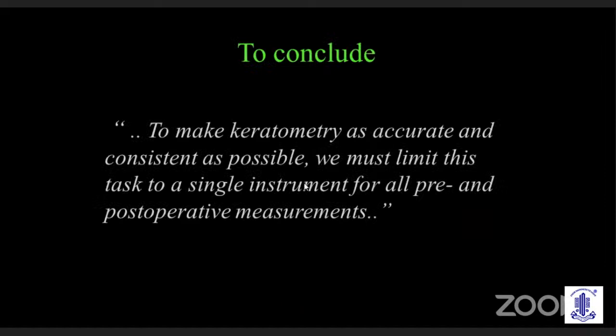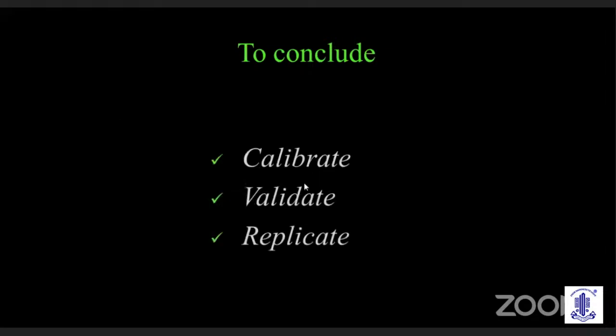So to conclude, to make keratometry as accurate and as consistent as possible, we must limit this task to a single instrument for all your preoperative and postoperative measurements. Kindly understand all the workings of an instrument and then go ahead. Make sure you calibrate the instrument periodically. Validate all your measurements before you finally reach a conclusion. In case of doubt, always make sure you replicate the values at multiple points. Thank you.